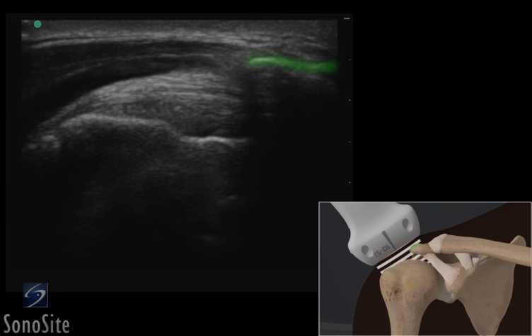The acromion and greater tubercle of the humerus are seen as superficial, bright, hyperechoic structures. The bird beak-shaped supraspinatus tendon and the bursa are located just superior to the humerus.